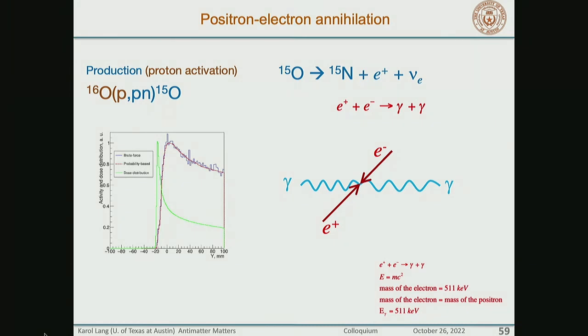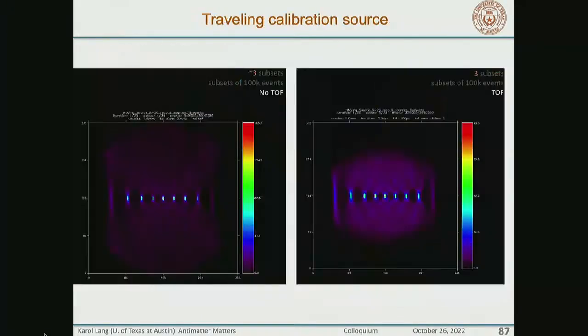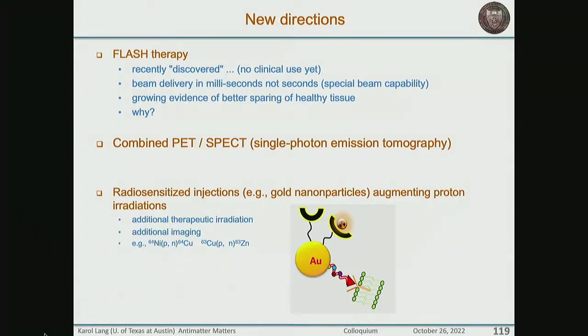So one of the beautiful things about FLASH, and this is what we're going to be arguing in the NIH proposal, is that I can actually accomplish faster throughput of patients than slower. Because the dose that you apply to a patient doesn't require 30 irradiations. It requires typically 4 or 5, as people think. People think because it hasn't been done.